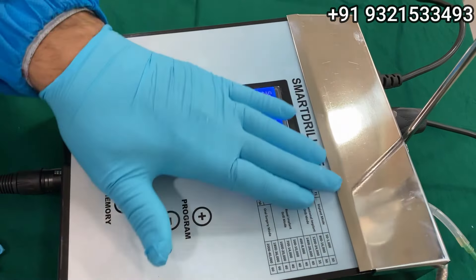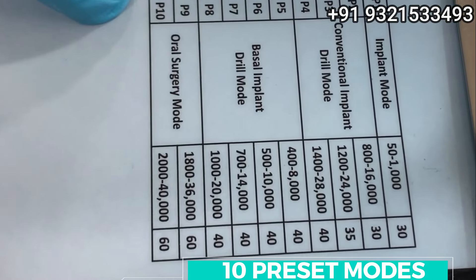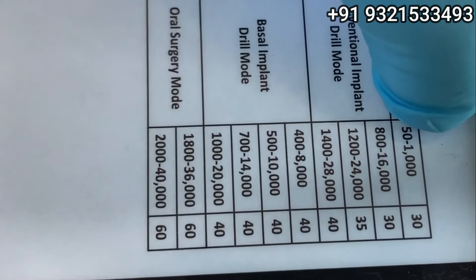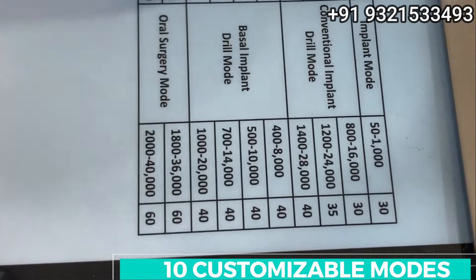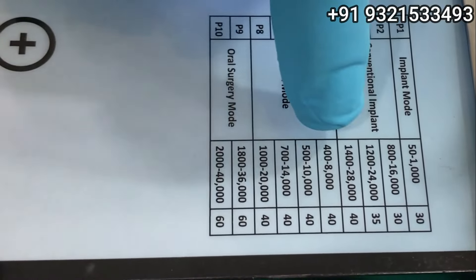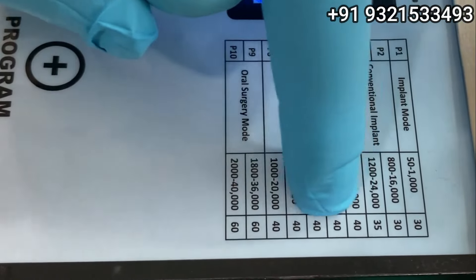Now, absolute crystal clear digital display. The best part is these 10 preset modules. Implant mode is for placing implants — for conventional implant drilling we start at 800 RPM with 30 Ncm torque, then 1200 and 1400 RPM for P2, P3, P4. Programs P5, P6, P7, P8 are for basal implantology. In basal implants we use the 1:1 handpiece — at 8,000 RPM for pterygoid implants, then 10,000, 14,000, and 20,000 RPM.